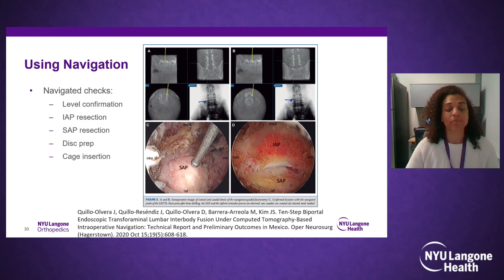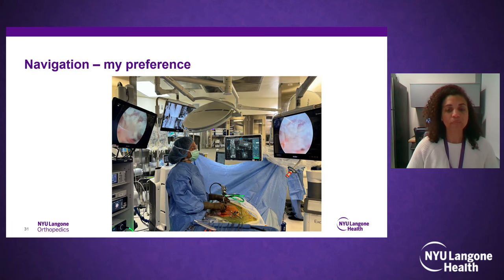So I'm not saying that you should give it up, but it just really helps in the learning curve. And then you can keep using it, and you just don't have to refer to it as much. But it's always nice to be able to check where things are and just confirm. And then also, it's great for teaching. So it's just really easy to let residents and fellows point things out, and then I know that they know where everything is and they can proceed safely.